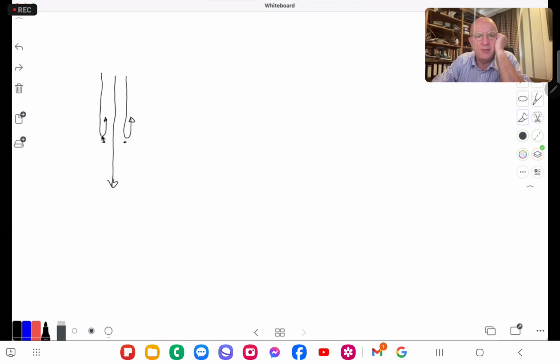So this beam gives you a bip, this beam gives you nothing, and this beam gives you a bip. So if that was the case, then you would know that there's two things here, one here, and a gap in the middle here, because that beam went through. If these beams were this wide, that would work. If these beams were this wide, then that wouldn't work, because this is too wide to fit in the gap there. So some of it would always reflect back.